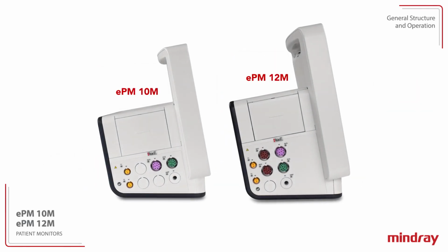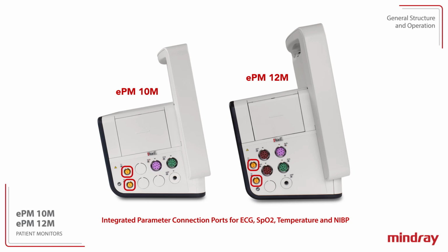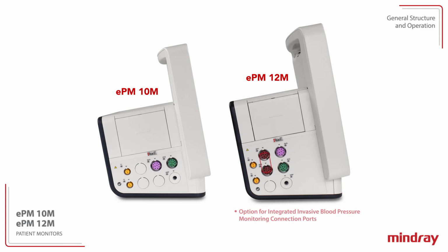The left side of the ePM 10M and 12M patient monitors contains integrated parameter connection ports for ECG, SpO2, temperature, and NIBP. Each parameter port is color-coded to match the respective cable. The ePM 12M patient monitor includes the option for integrated invasive blood pressure monitoring connection ports.